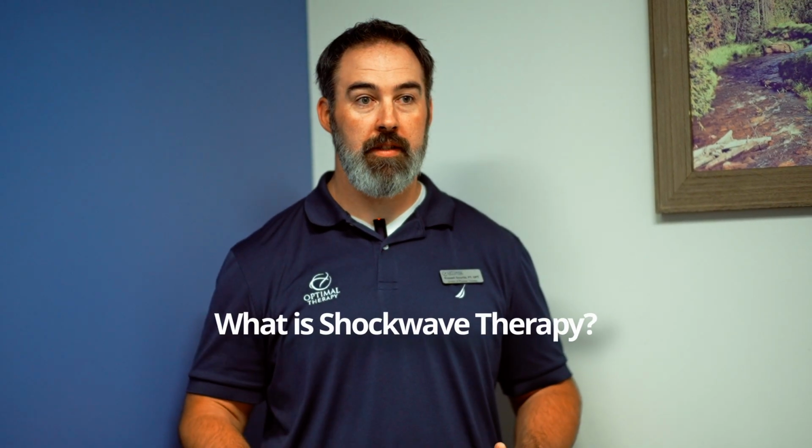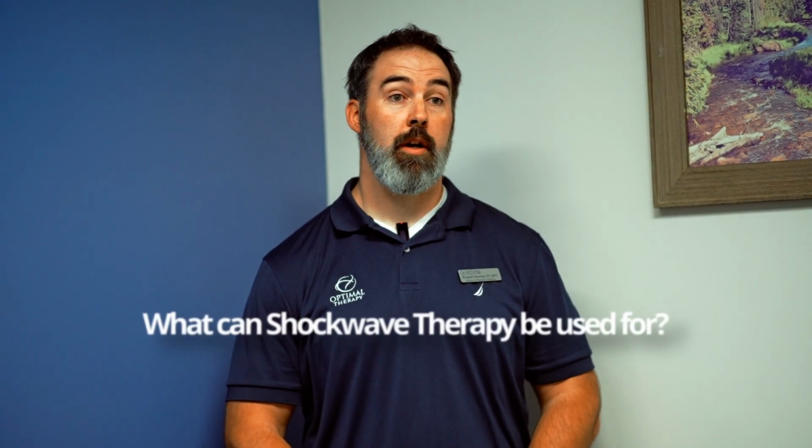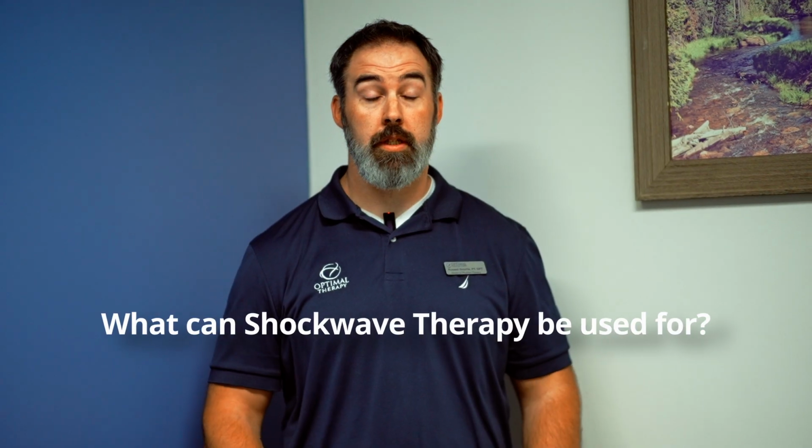Shockwave therapy is a non-invasive treatment. It looks very similar to ultrasound, but instead of using sound waves, it uses a low amplitude percussive force to affect the tissue. The conditions that we can treat with shockwave therapy are a lot of overuse injuries, so tendinitis or tendinosis type injuries, tennis elbow, Achilles tendinitis, plantar fasciitis, golfer's elbow.